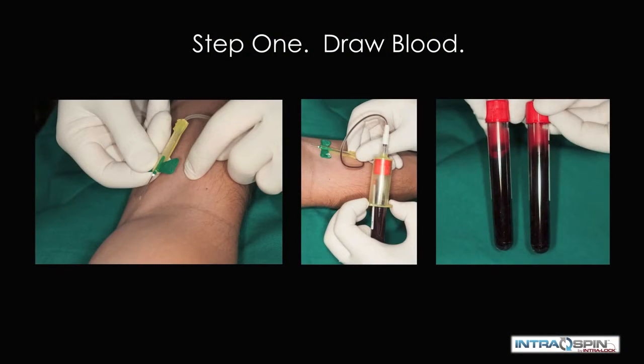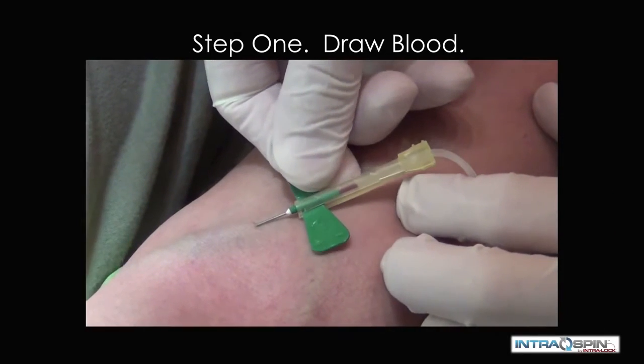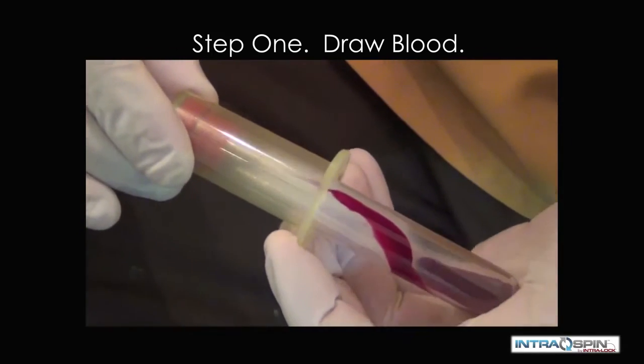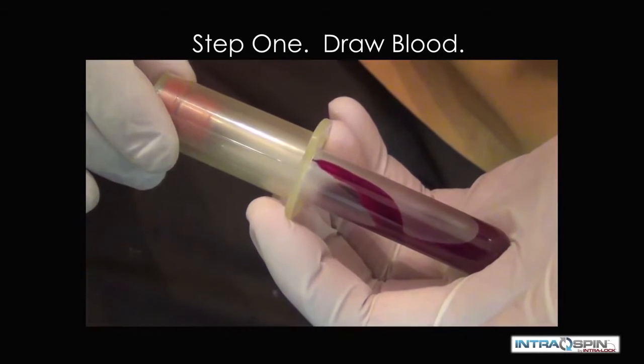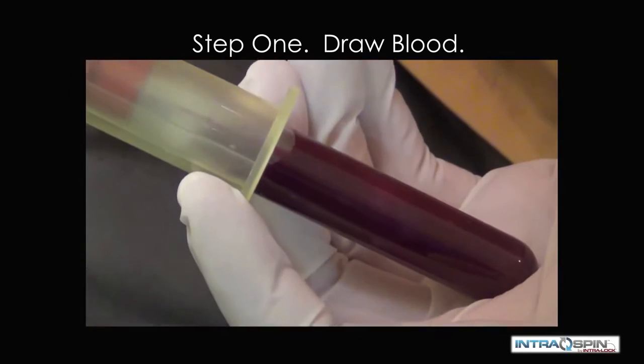The first step is to draw blood. The needle set enters at a 15 to 30 degree angle, and blood collection tubes are used to harvest whole blood from the patient. We do this in even numbers before they are placed in the centrifuge.